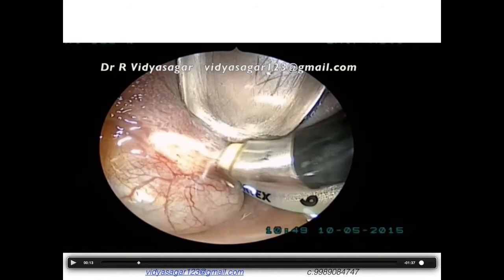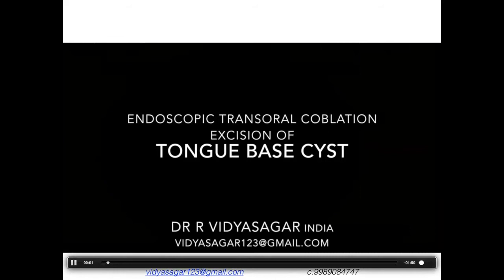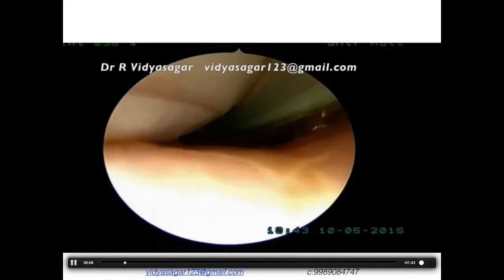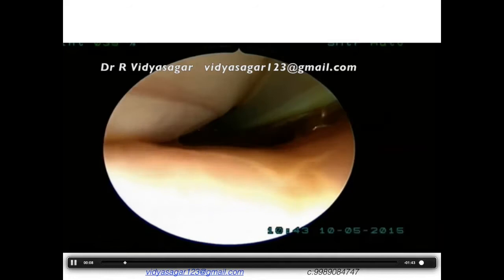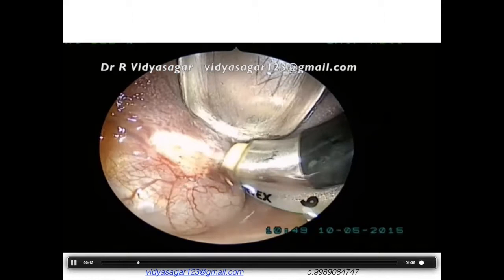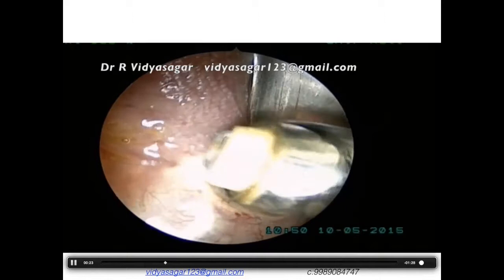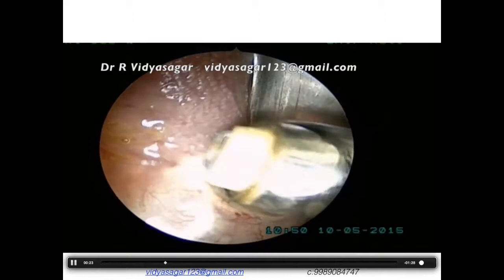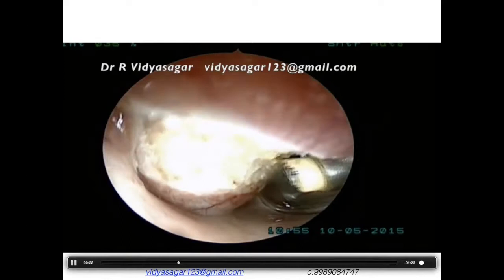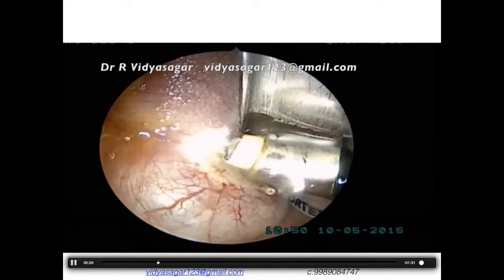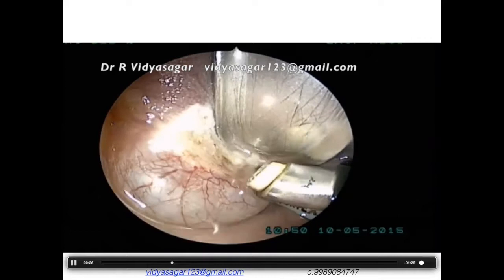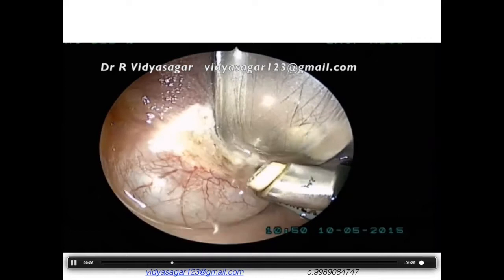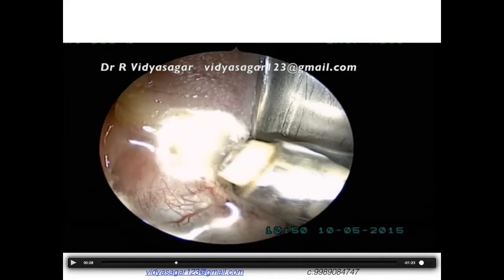We intubated the child with nasotracheal intubation using a regular Mackintosh laryngoscope. With the coblator in one hand and endoscope in the other, and assistant holding the laryngoscope, we applied the coblator while leaving a one millimeter space between the lesion and the wand — this is very important. You need the plasma interface for coblation to work; only with a millimeter gap will the ablation procedure work.